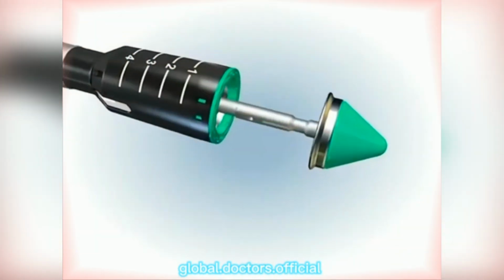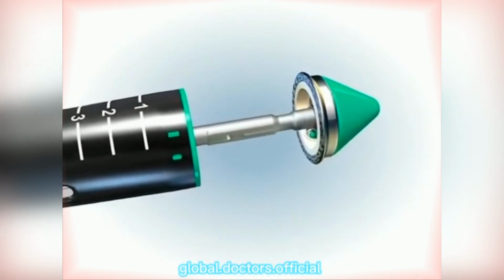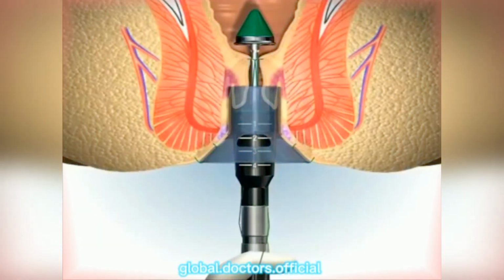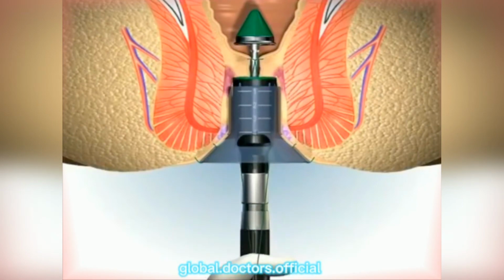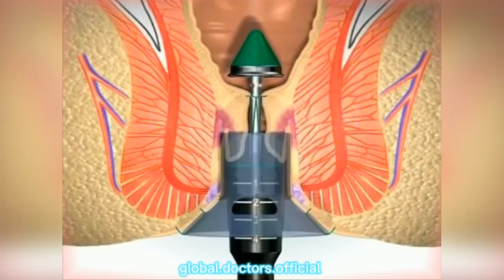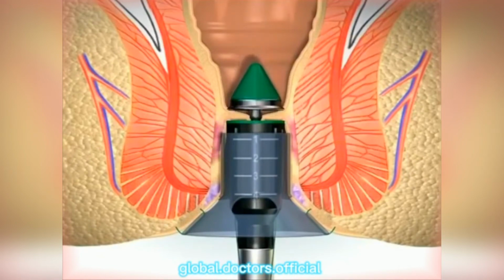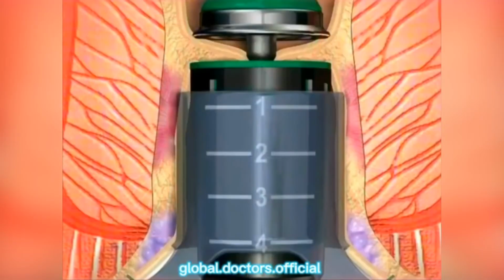The anvil is fixed to the rod to avoid accidental detachment, and the stapler shaft is shorter than in conventional circular staplers. As the stapler is tightened, it is gently pushed into the anal canal, while moderate traction is maintained on the purse string, so that the prolapsed mucosa begins to be drawn into the stapler casing. The stapler is examined to ensure that it is aligned along the axis of the anal canal.